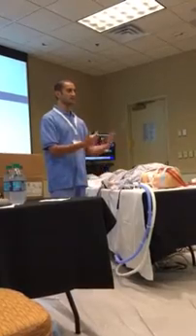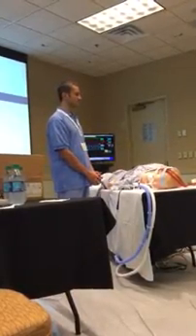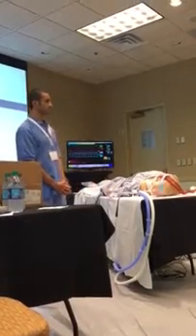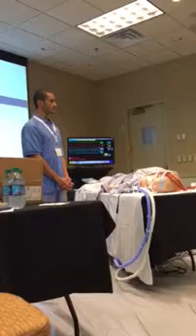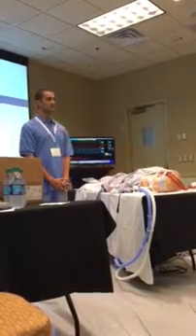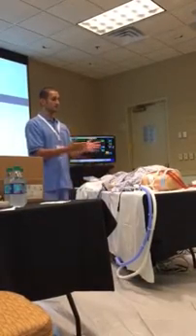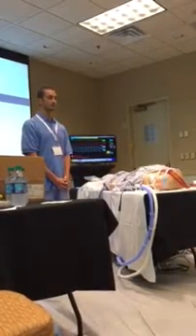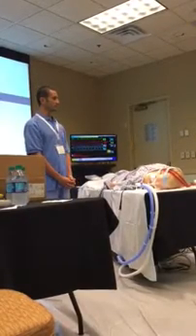Do you guys have a standardized approach to this? Or things that you think about early on and what you can do quickly? I thought that was a very good question to ask about the color differential. I agree, because you see that right on the patient. That is the first thing I do. Whether or not the patient's hypoxic, if I walk into a patient on ECMO, the first thing I always do is look for that color change, especially if someone's hypoxic. And the reason is you can get a lot of information.